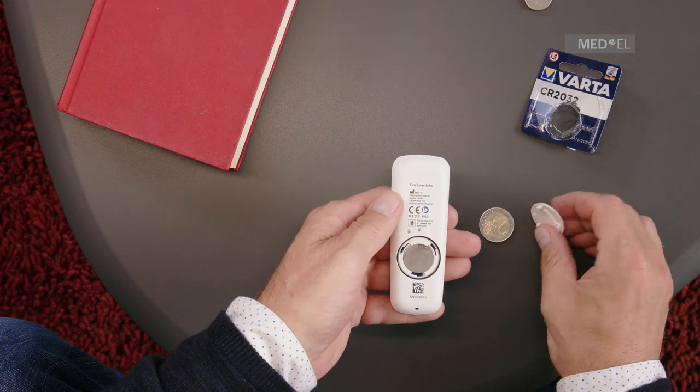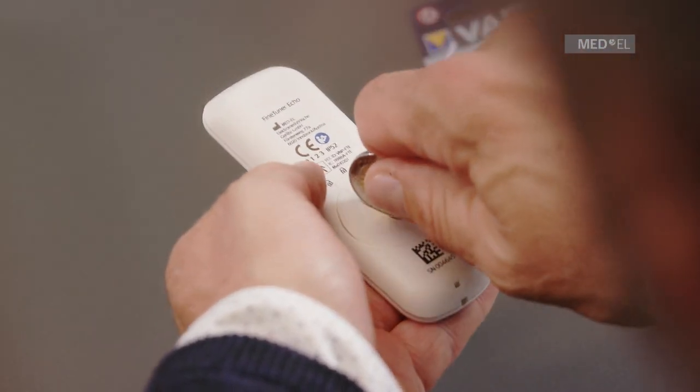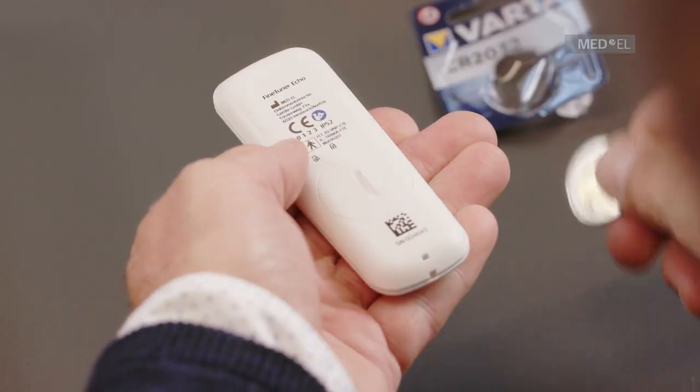Place the cover over the battery compartment, pointing towards the unlocked symbol. Using a coin, turn the cover until it points to the locked symbol.